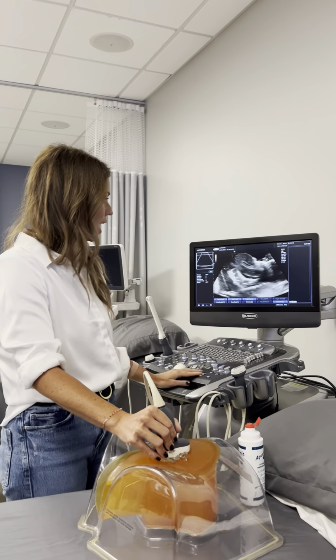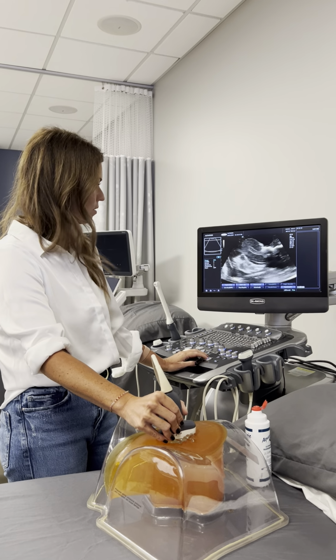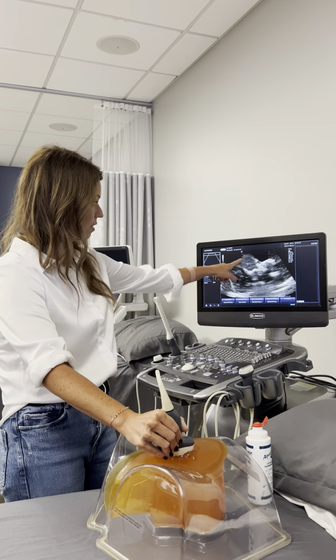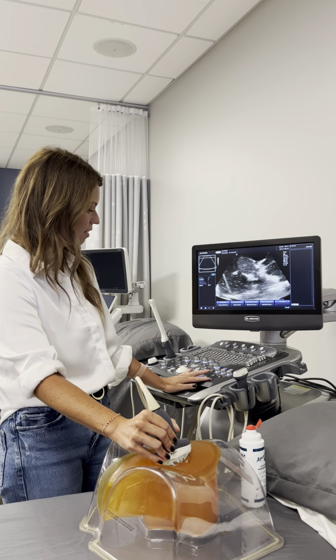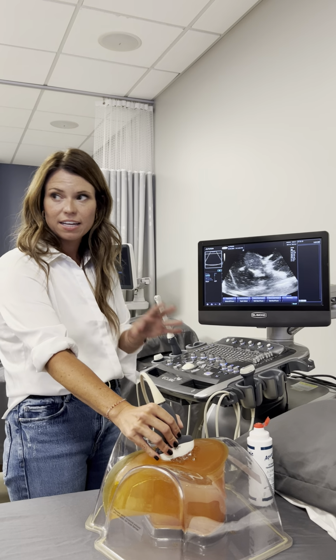We'll scan. I'm going to do a sagittal view here. I'm going to go to the right, push, take a picture there, and I'm going to go to the left and look this way. I'm surveying the whole uterus, right?